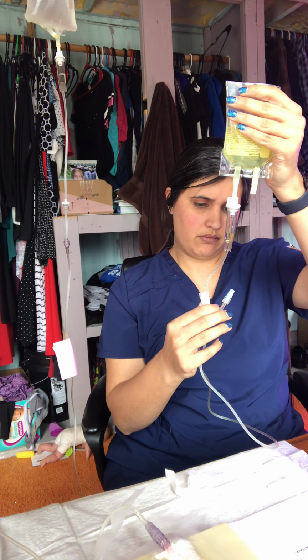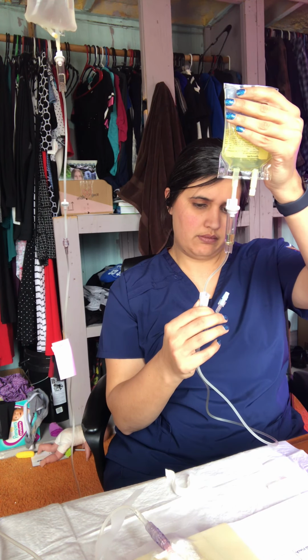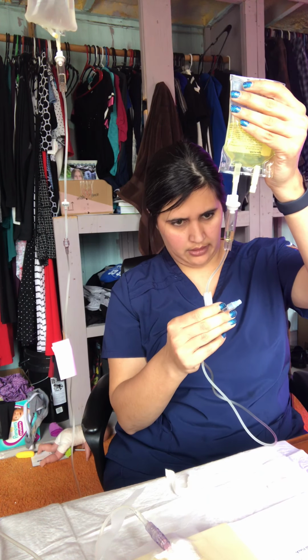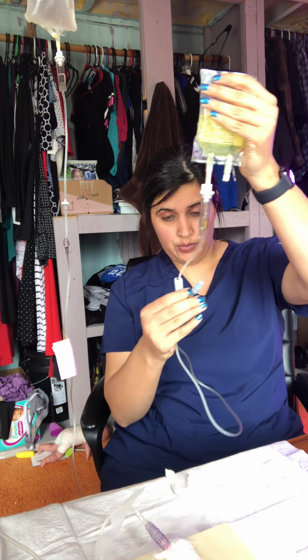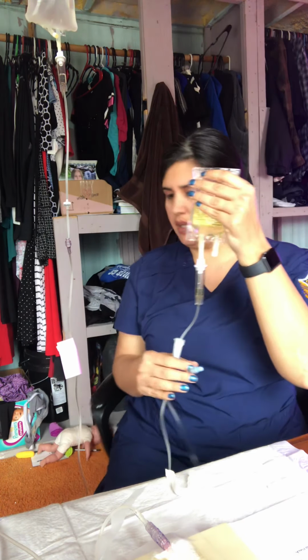Priming. Okay. Tube is primed. And I've locked it back up.